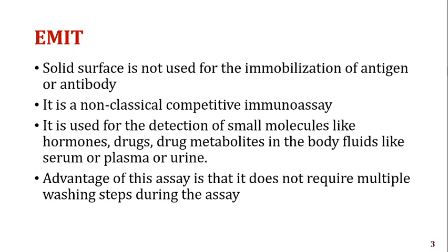Similarly, drugs and drug metabolites which are found in the body, which are used for the clinical purpose, if they are not acting in the person, it could reflect on the liver function. So therefore, the normal clinical investigation of these molecules by using this technique can help in diagnosis and pinpointing what is wrong in the person.